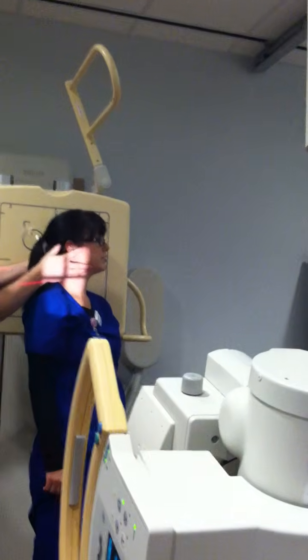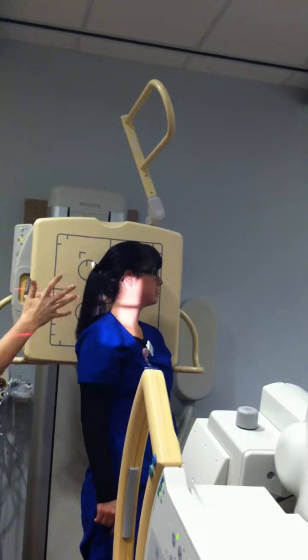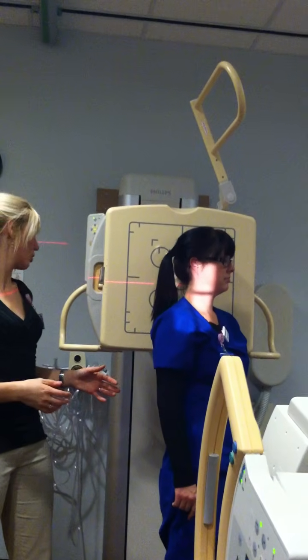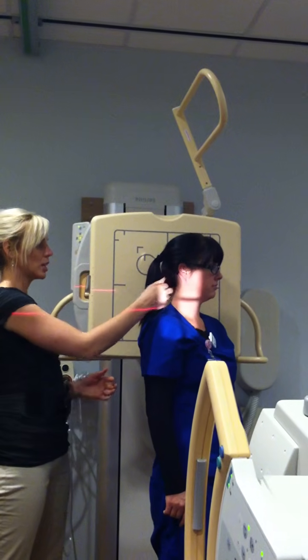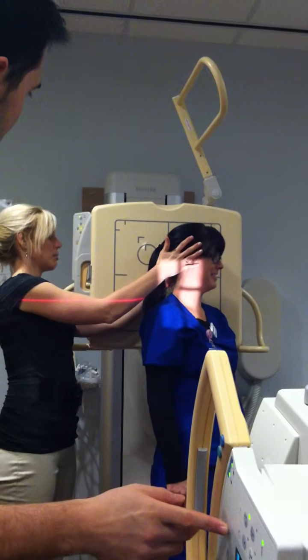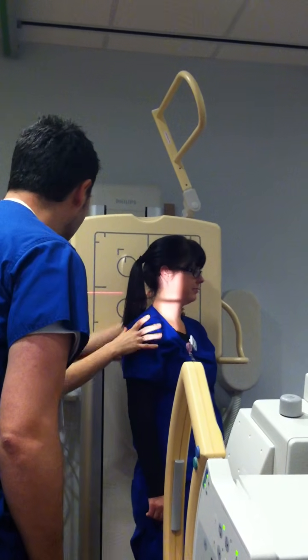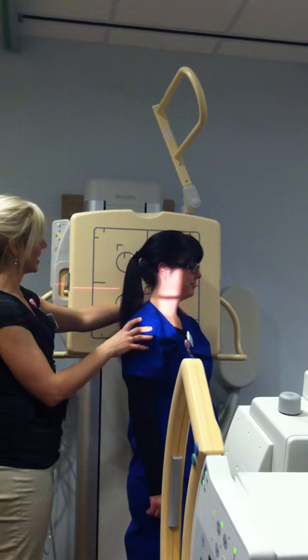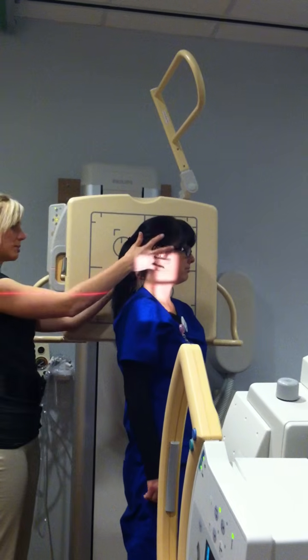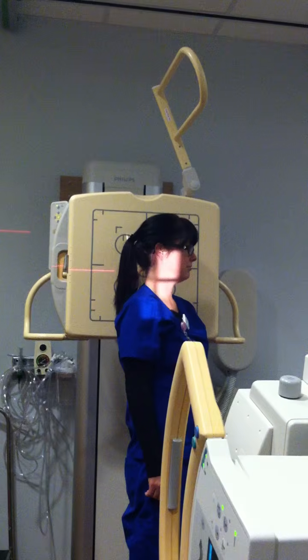You'll see a lot of techs overdo the head. They'll turn their head all the way to face that wall. We don't really need them that far. You want everything in the body to be 45. If you're overdoing it, sometimes these ones up here will be closed. But you also don't want them looking forward either. So a nice 45 here, kind of maintain. We have her looking off in that direction, but not excessively. She stepped forward too now. We make sure the head is nice and straight. We don't want tilt on these because sometimes they'll tilt one way or the other, and that'll close those. So I really like it.